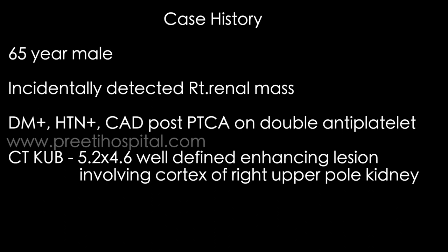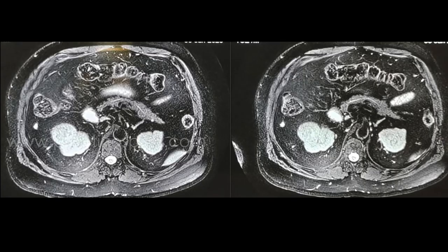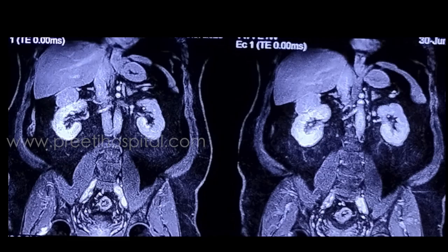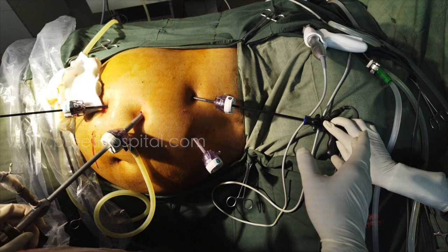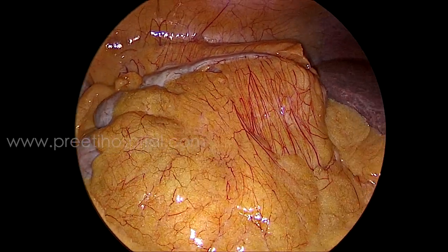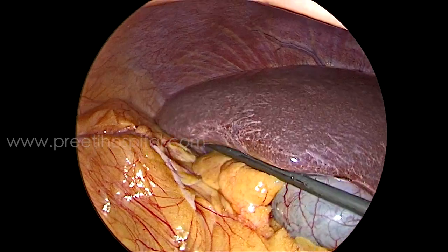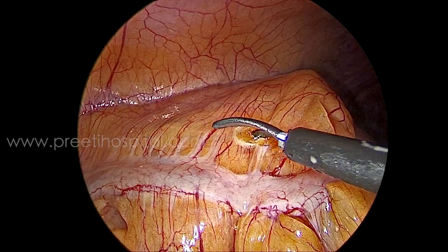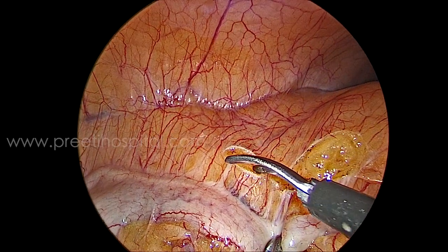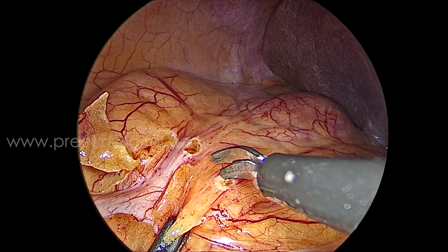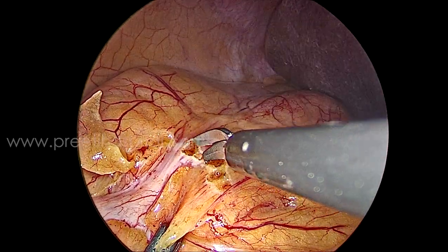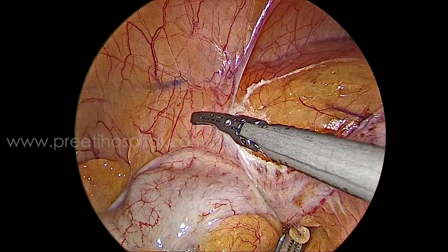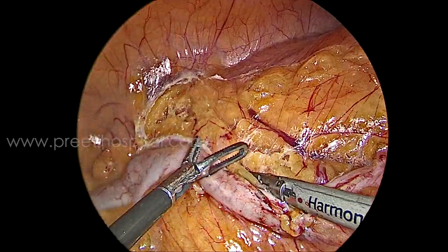You can see this type of obese patient, but the fat will be separable from the renal parenchyma most often. This is on the right side where you can see the liver. We saw two humps. Initially I thought I would try with a scissor, but I realized soon that so much fat is there — better to switch over to the harmonic, because a lot of fat was present.